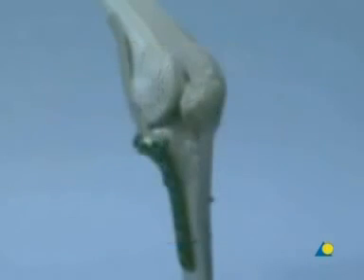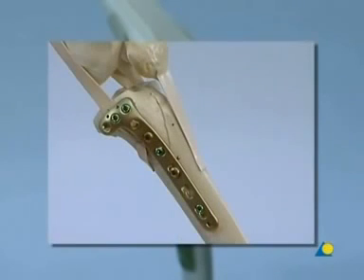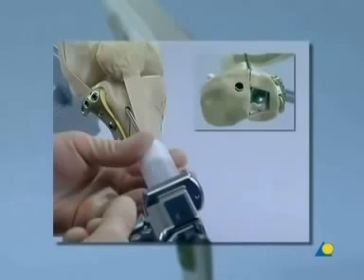The use of 2 separate incisions to minimize soft tissue trauma. The fixation of the single large medial block of bone first, which helps anatomical reduction of the lateral compartment. The use of the LCP plate placed laterally in buttress mode. And the use of a bone substitute, Chronos inject, filling the subchondral defect created after anatomical reduction of the surface of the lateral tibial plateau.